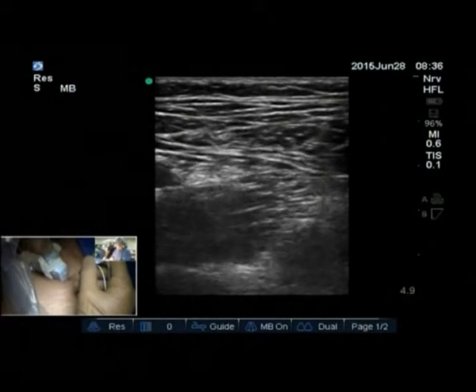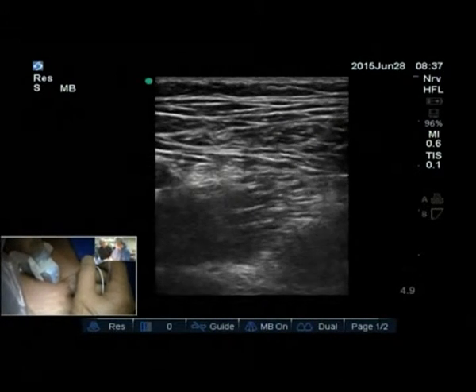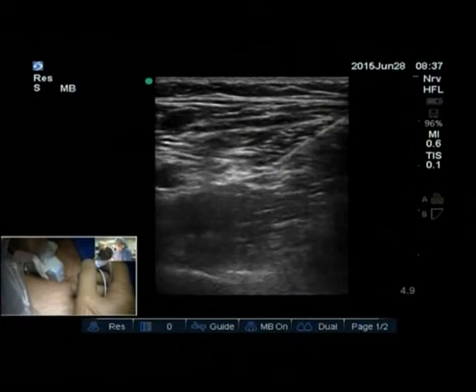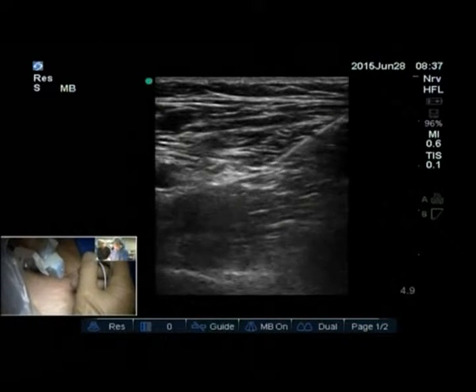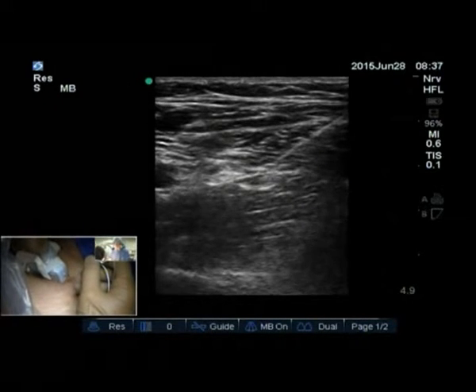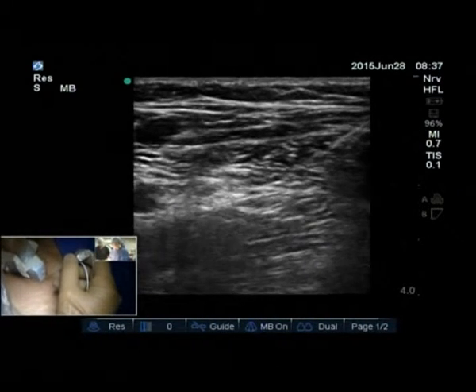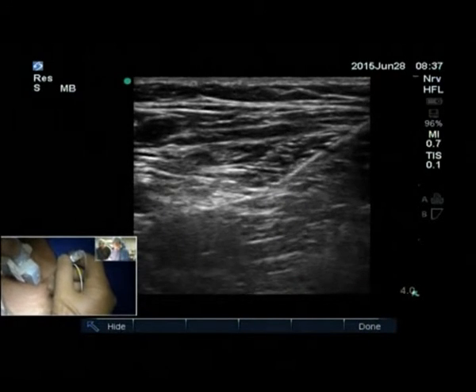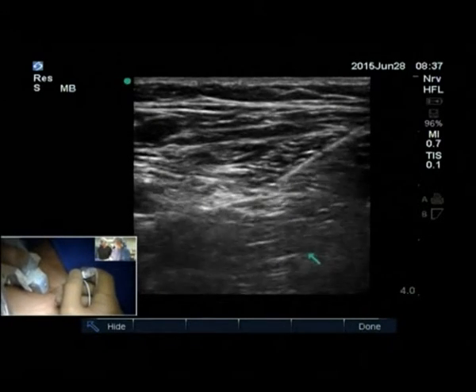So when you go in, again, I jiggle the needle. I want to see approximately where it is. I know I'm close, so the next thing I do is I'm just moving my probe. It's okay, I can see it. So I can see the needle very well. In fact, I don't need so much depth. We can decrease the depth a little bit. It's written as 4. That indicates the depth. So right now I'm right at the apex. So this is where I want to puncture.